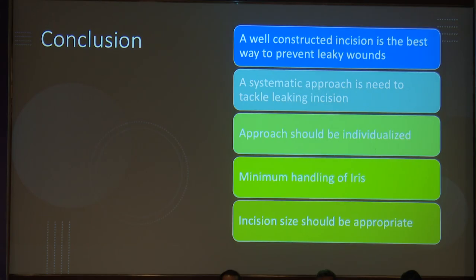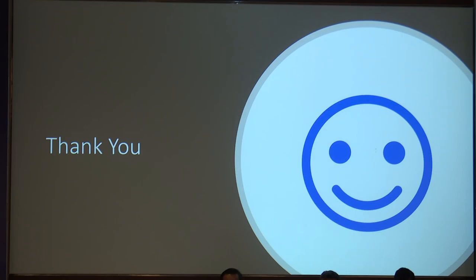I'd like to conclude that a well-constructed incision is the best way to prevent leaky wounds. A systematic approach is needed to tackle a leaking incision. The approach should be individualized. You don't have to go with a fixed mindset of I'll do this and then I'll do this. There should be minimum handling of the iris and the incision size should be appropriate. Thank you very much for your attention.